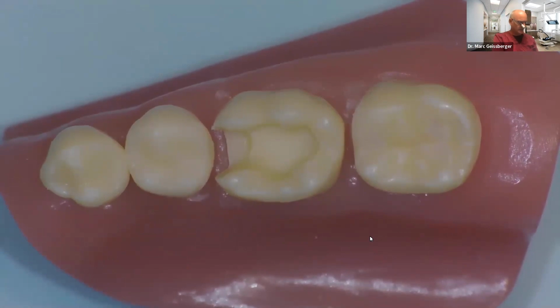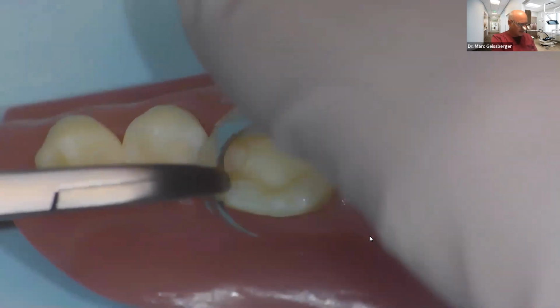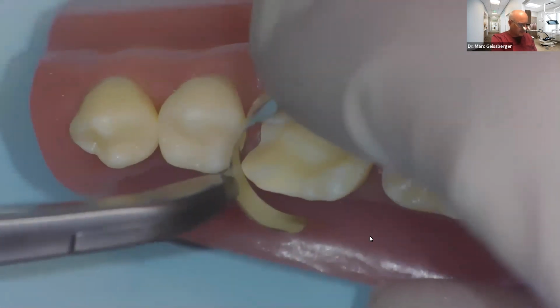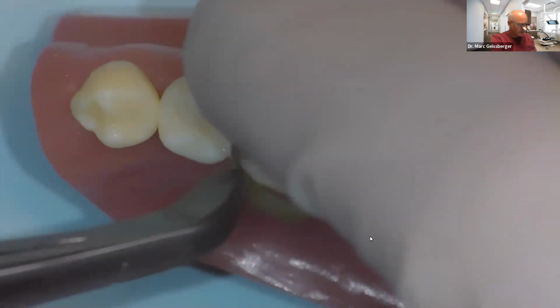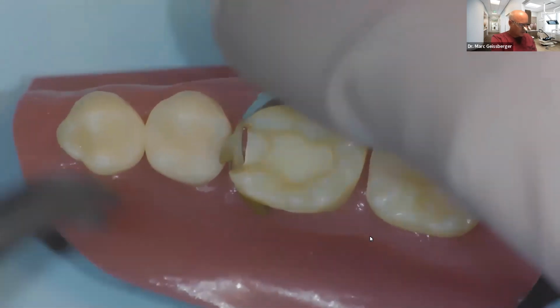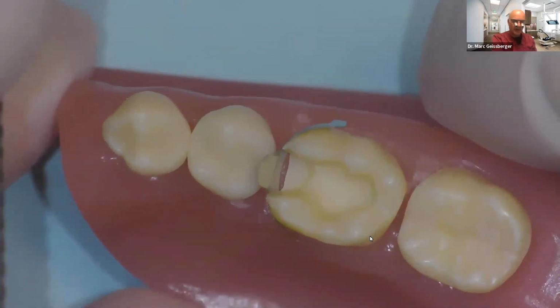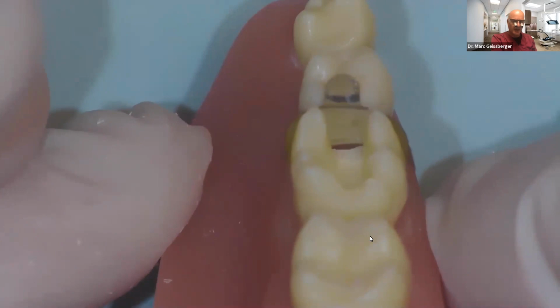Now, most matrix bands come in a variety of heights, and I am going to place my band in the mesial here. Bear with me for just a second. If my finger blocks your view, I apologize. I'm going to angle that just a bit and slide that in there and get that going. There we go. Now, what I want to make sure is that this band is, number one, centered mesiodistally. So I want that centered.